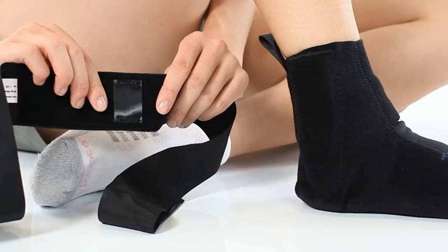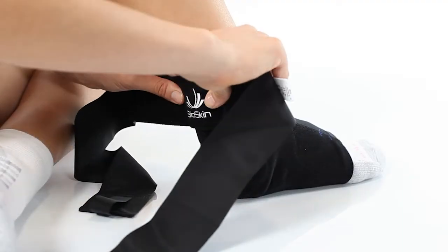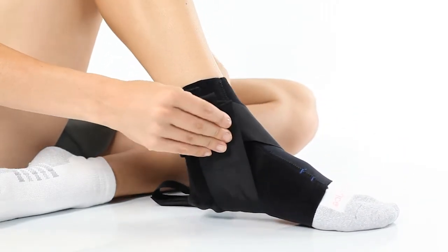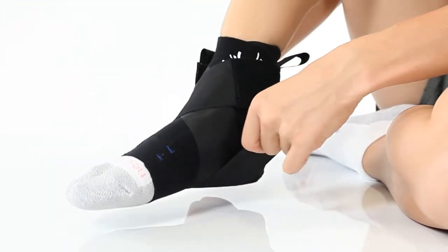Next, apply the stirrup strap. Begin by attaching the velcro tab in the middle of the stirrup strap to the back of your ankle. Wrap the outside strap around the inside of your foot and attach it to the outside of your ankle. Now wrap the inside of the strap around the outside of your foot and attach it to the inside of your ankle.